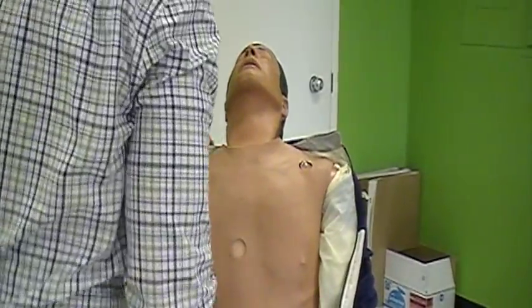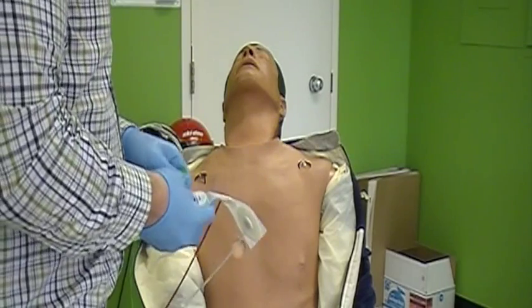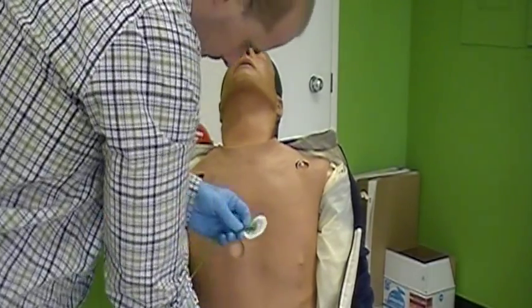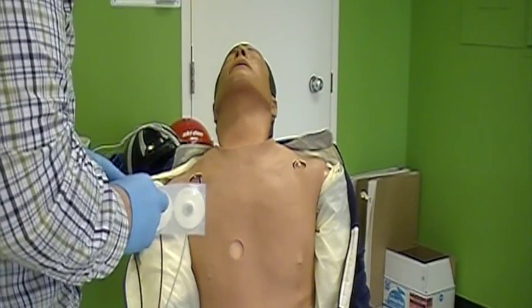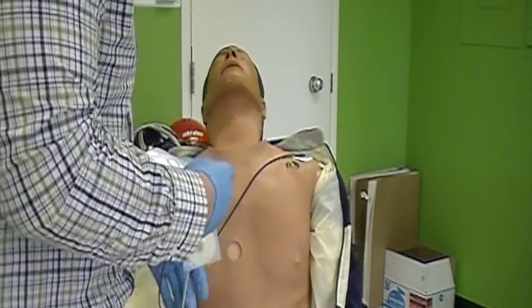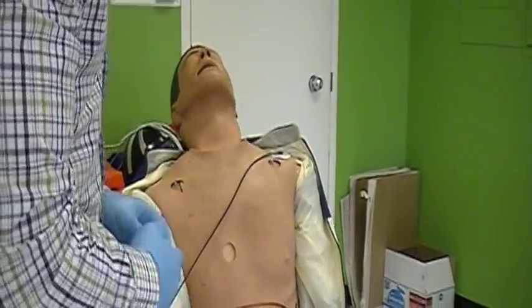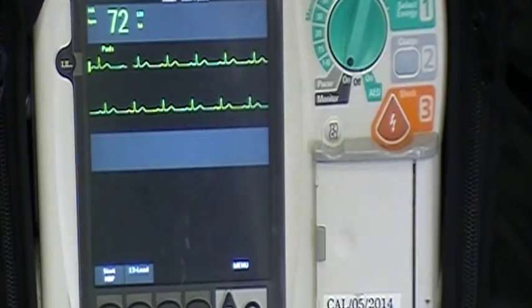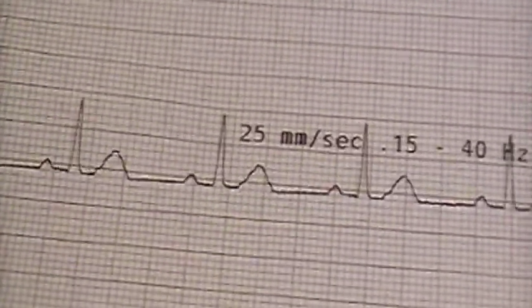To apply a 3-lead, expose the patient's chest. Attach the cables to monitoring electrodes and clean the area where the leads are to be applied if required, such as shaving hair or wiping off sweat. Apply the black lead to the left shoulder, the red lead to the left lower abdomen, and the white lead to the right shoulder. Print a strip and interpret the findings.